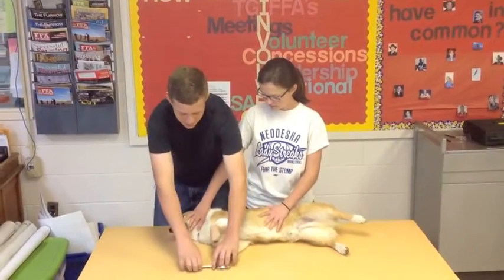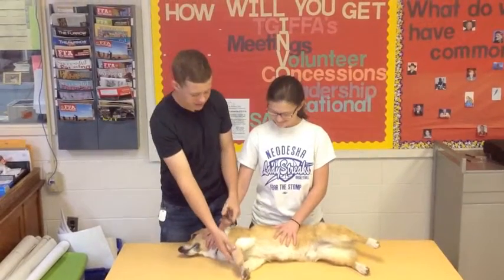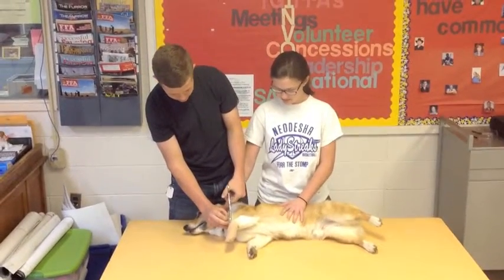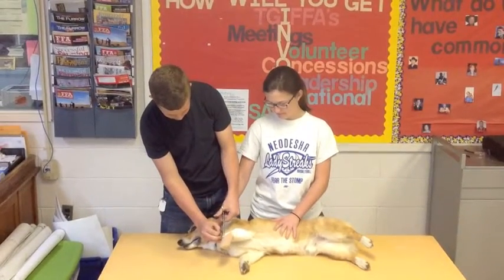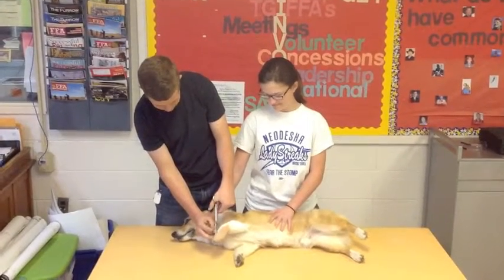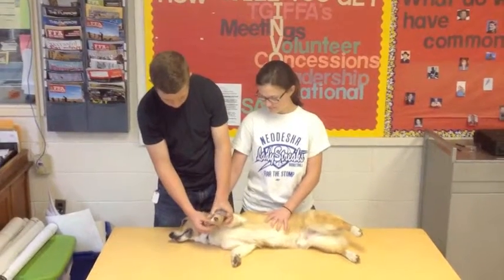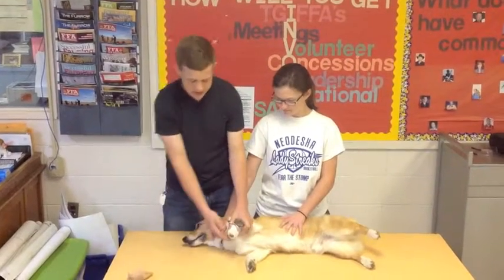For this procedure, we will be using bandage scissors. You will need to start at the top of the bandage, pull it up just enough where you can get your scissors started to cut, and slowly take off the top layer of the bandage. Once you've done that, remove the first layer of the bandage and set it aside.